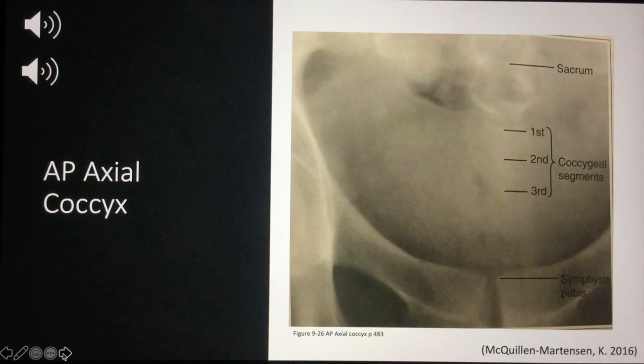I believe this image is a little bit underexposed, and it has a lack of detail because the AEC could have been malfunctioning, or the mAs was too low. To fix this image, I will move the central ray a little bit more to the right side of the patient to center it properly, and I will change the technique by increasing the mAs.